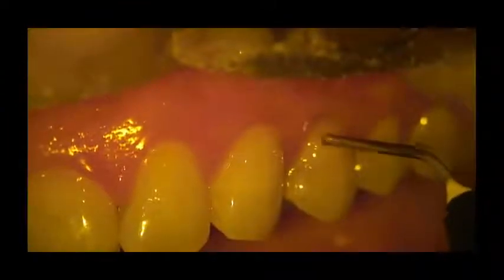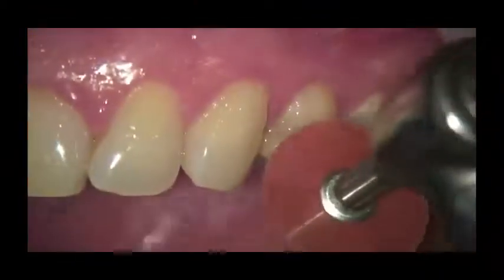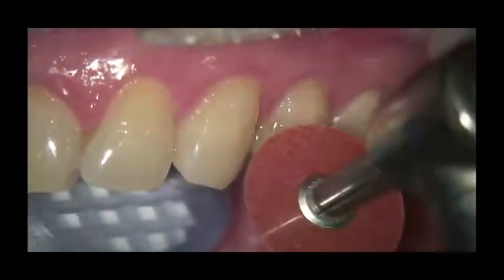You can use any kind of instrument, but I've always used a periodontal probe to move it around. Then we light cure these fully. And now for finishing, I really like finishing these restorations initially with a Softlex disc. This is the Softlex XT disc, which is the extra thin mylar backed disc, and it flexes really nicely. So we move it into either forward or backward position and contour this really quickly.